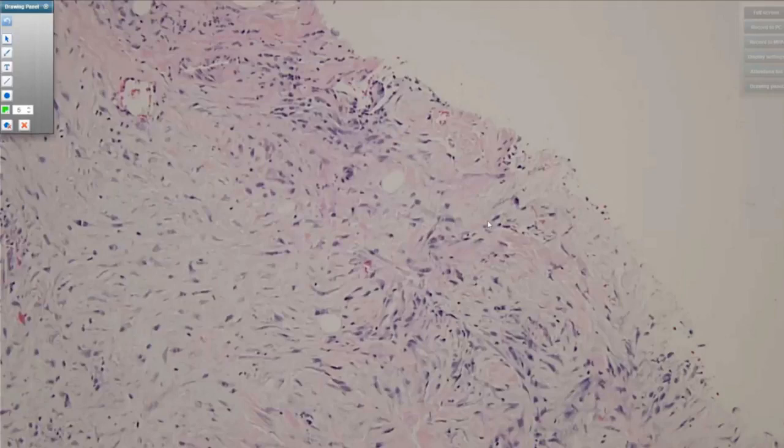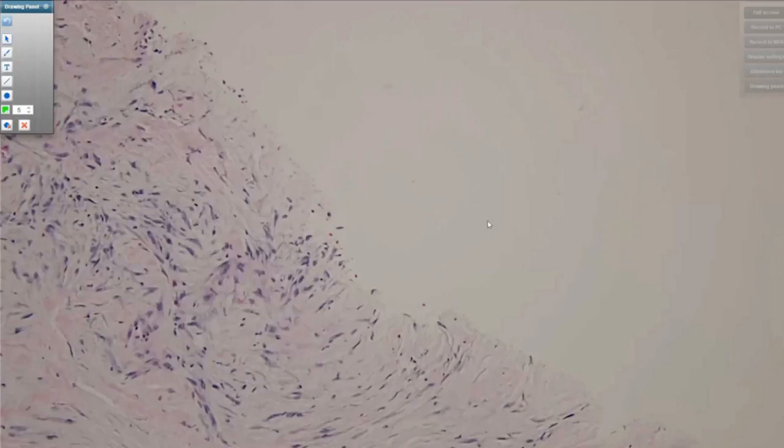And this really is the primary diagnosis that we try to exclude every time we see a bland spindle cell proliferation of the breast. I'd like to take a look now at an example of an actual fibromatosis involving the breast, so we can compare and contrast the features.